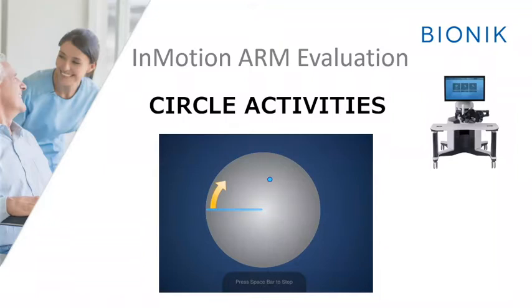The first task performed as part of the evaluation is the circle test. This is performed by having the patient draw as large a circle as possible from two different points along the circle in both the clockwise and counterclockwise directions. This is done to analyze the patient's active range of motion and coordination.